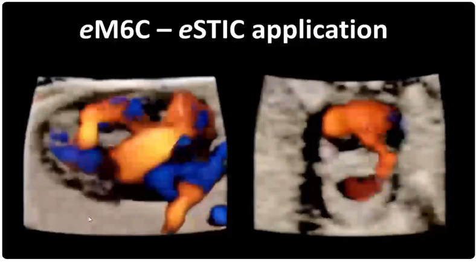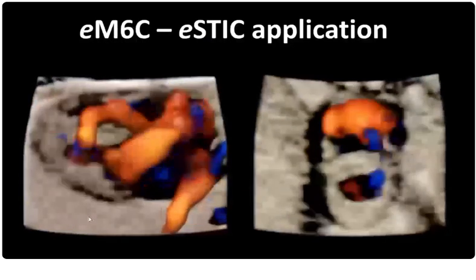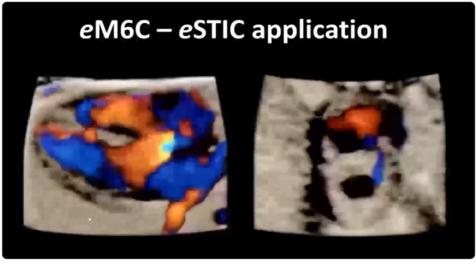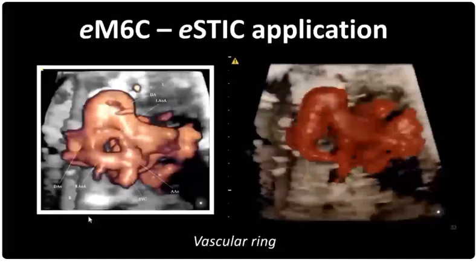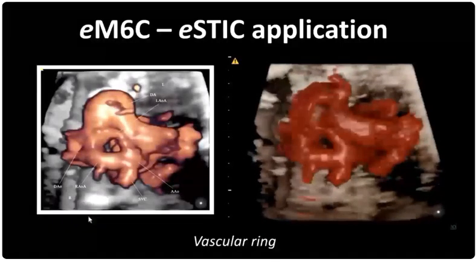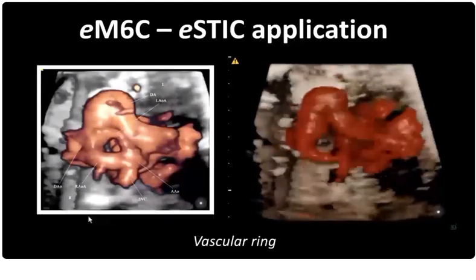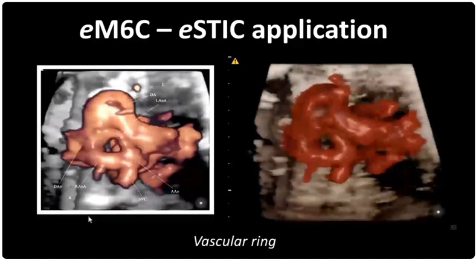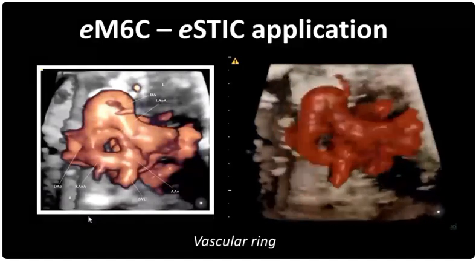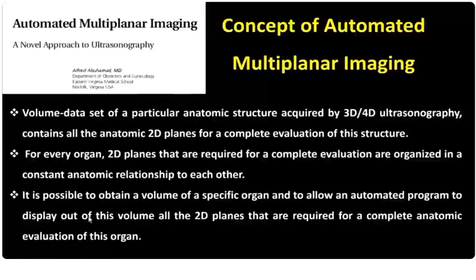We can locate anomalies such as the VSD very precisely, identify what segment of the septum is affected, and we can retrieve the longitudinal views and the cross-section views as well. And of course, we are then looking at the vascular structures, in particular in the superior mediastinum or in the abdomen. This is a very useful technique to reconstruct those vessels and find out the spatial relationship between them.